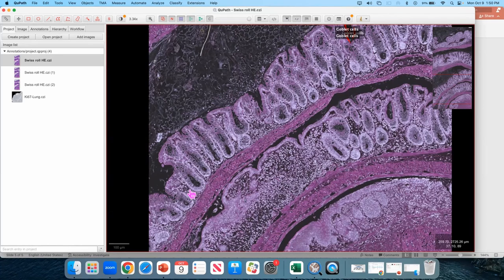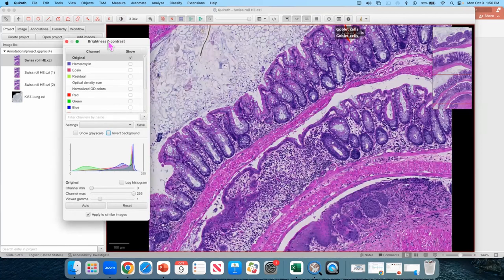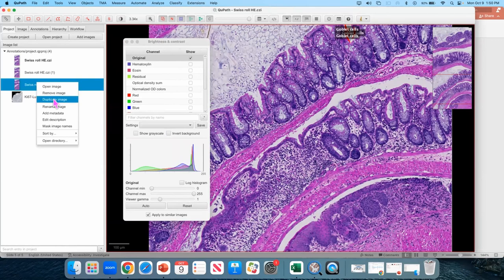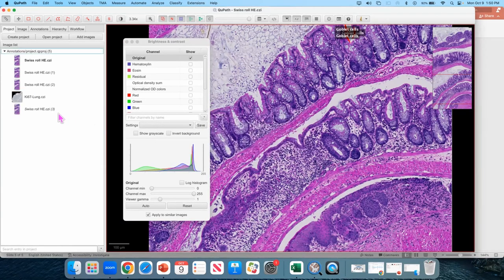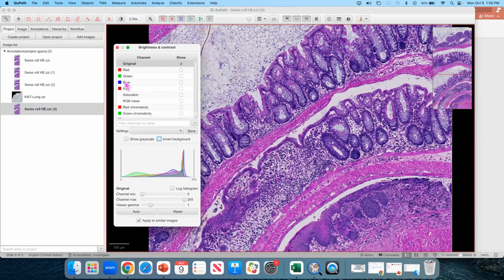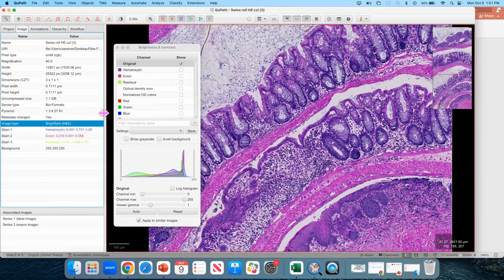The next thing we're going to talk about is image export. We will interact a lot with the brightness and contrast controls, and we can stay on our Swiss Roll H&E image. The first thing I want to show you is that if you didn't select the image type, or if that image type was incorrectly assigned, you're going to get a weird interface. So you want to make sure that the image type is appropriate.